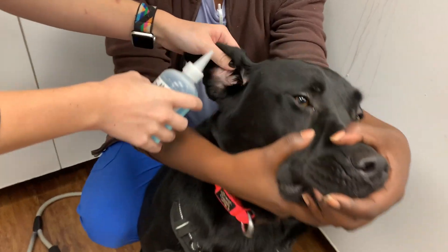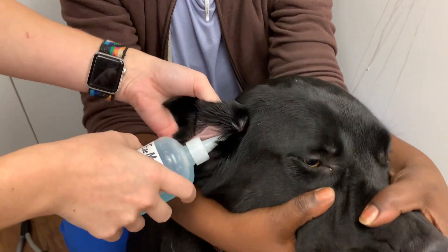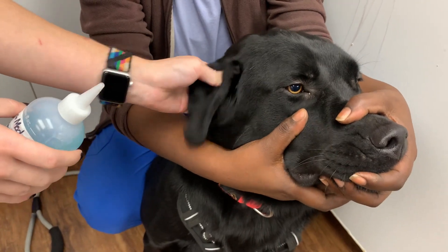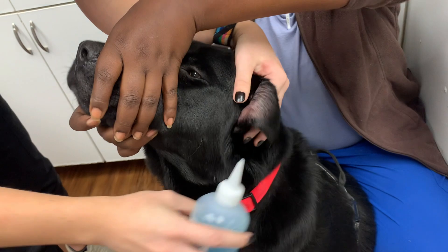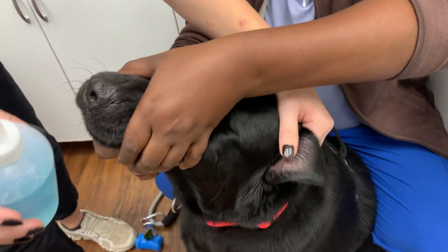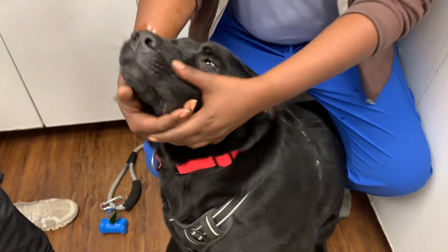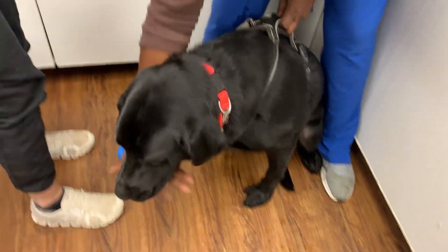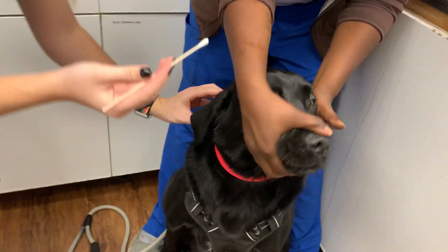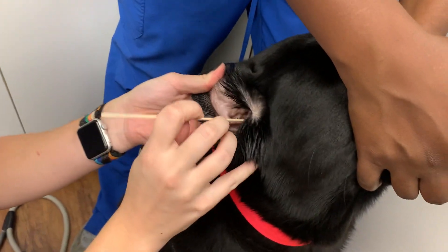I'm going to take some cleaner inside both ears. Then I'm going to take a cotton tip applicator to get deep inside the ear.